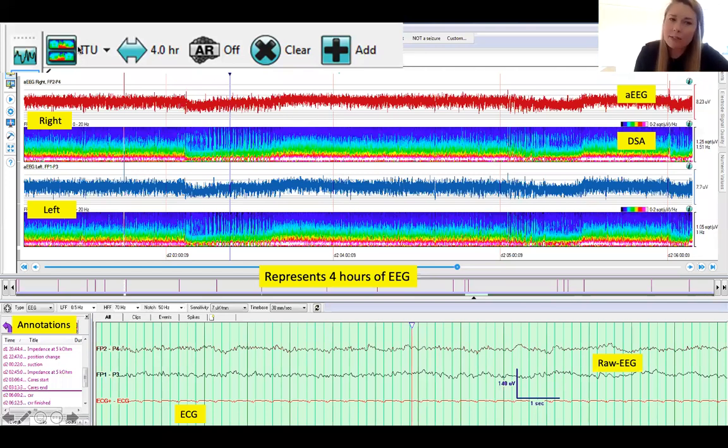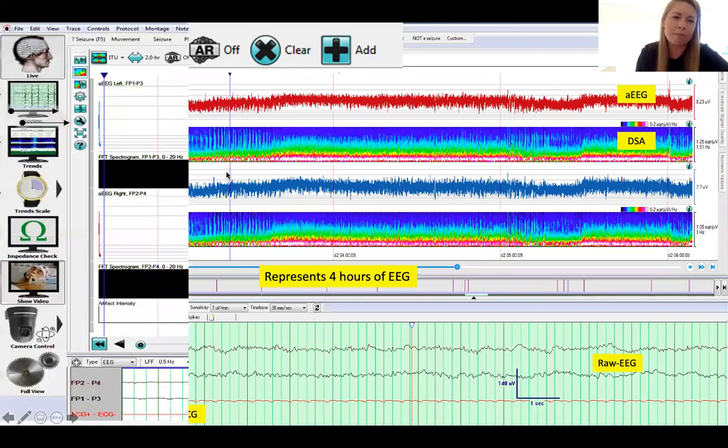And we also have different mode sets. So we'll have a neurophysiology mode set where we can run the full 16 channels of electrodes. And again, that's going to look very different. So just always make sure that your time base is the same.